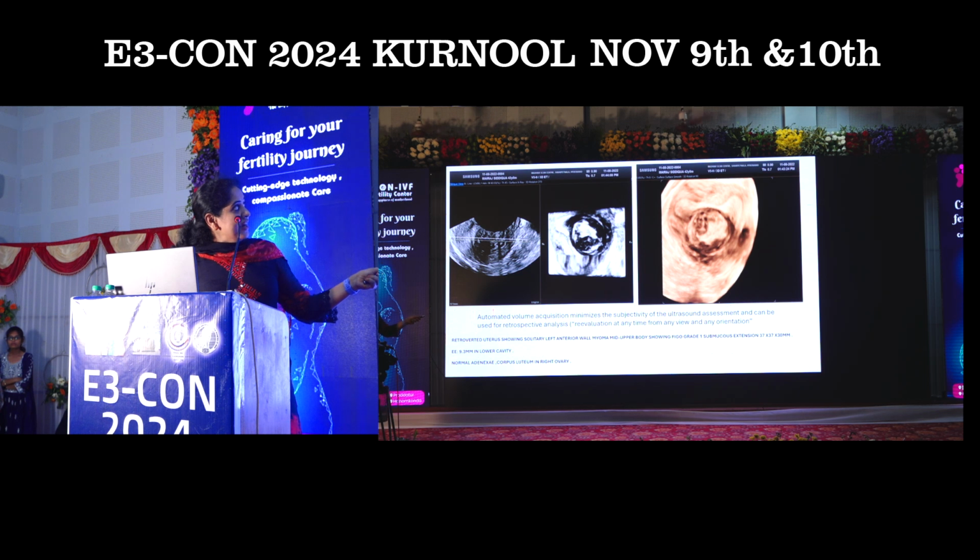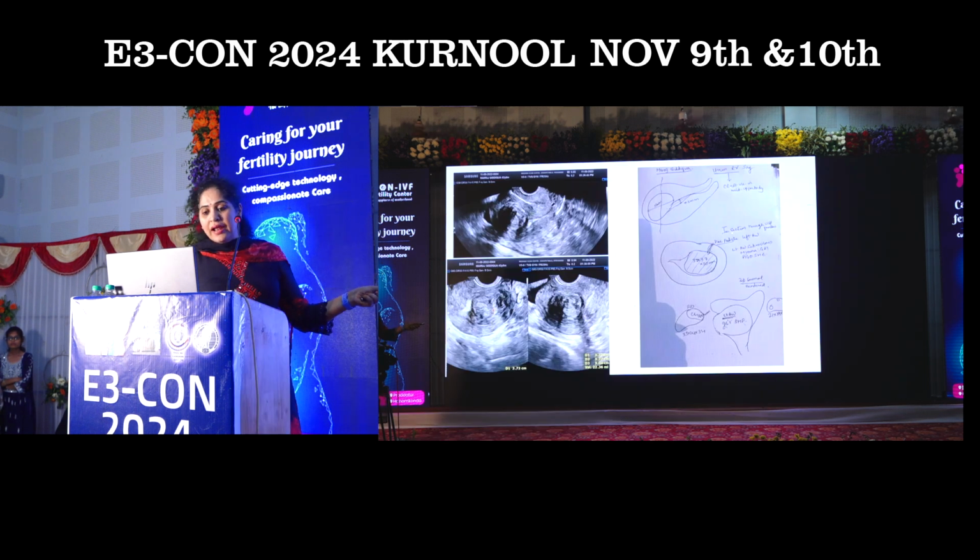And the same you can render in a 3-dimensional mode, and you can give a schematic representation for the surgeon to understand and decide on the surgery.